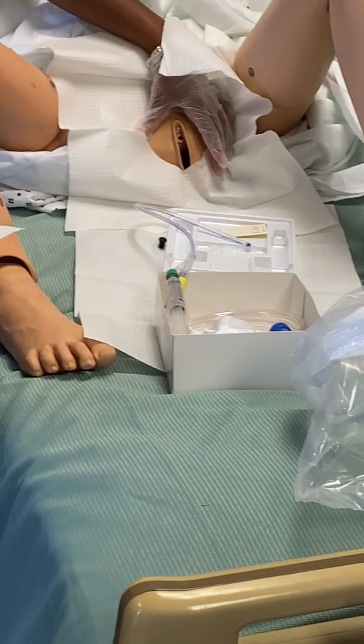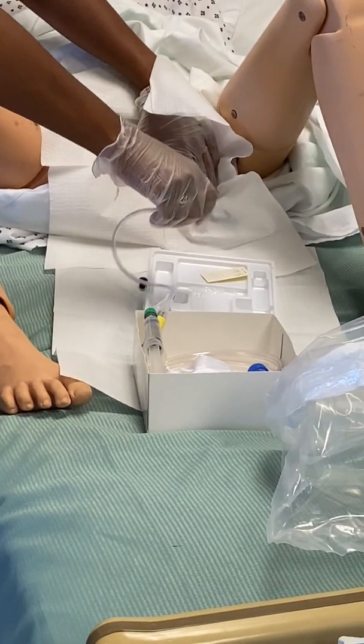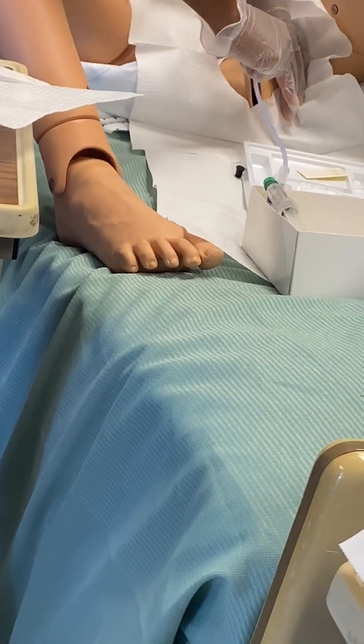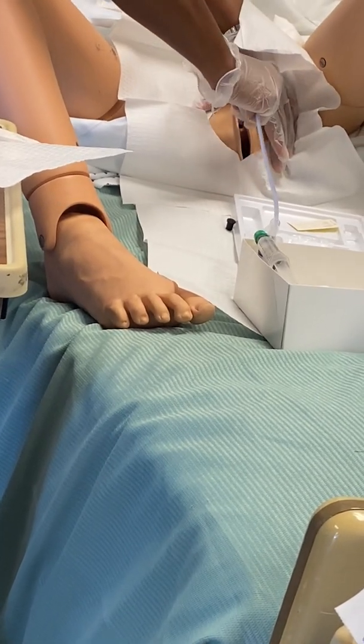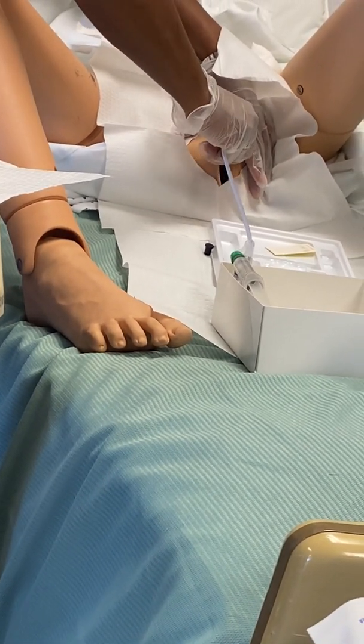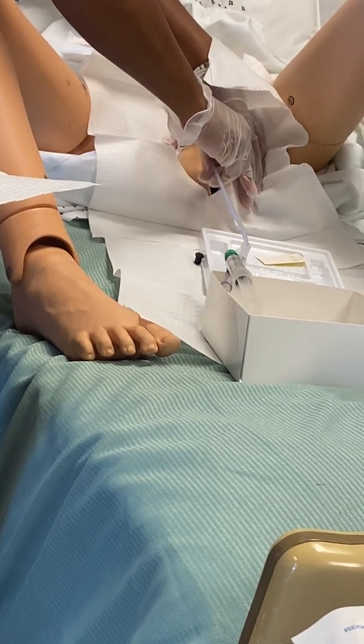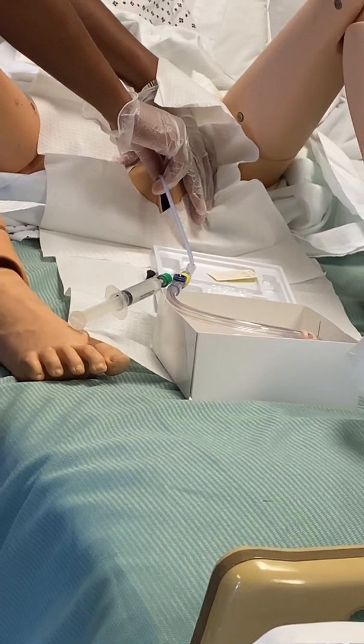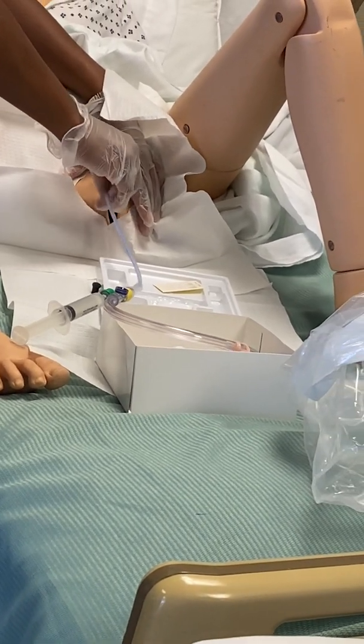Y'all understand that? Okay. So now she's clean. She's squeaky clean, okay? So now we're going to insert this catheter. I'm going to tell her to take a deep breath. And we're going to insert it. Okay, I see urine, so how much further do I insert? 1 to 2 inches. You got to look over your protocols.